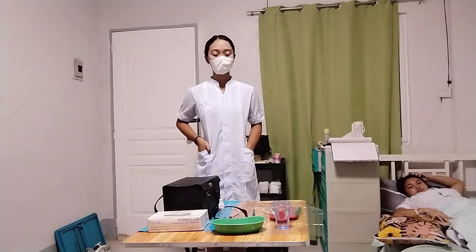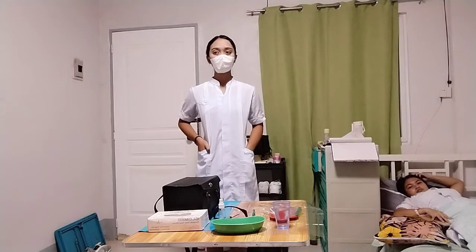State College of Nursing, BSN2C. So I'm going to perform sputum specimen collection.